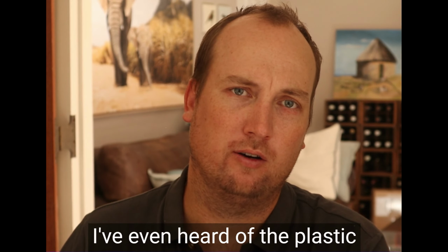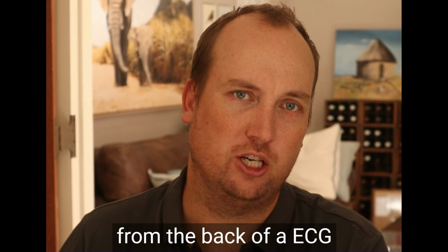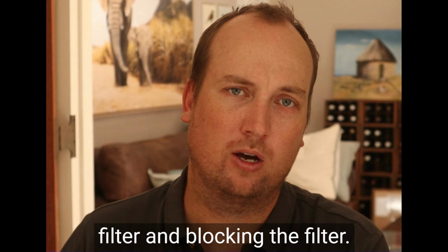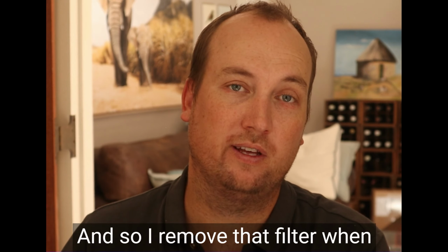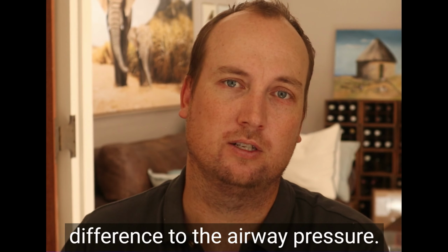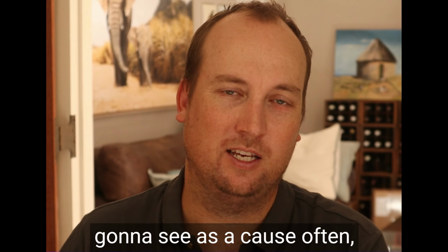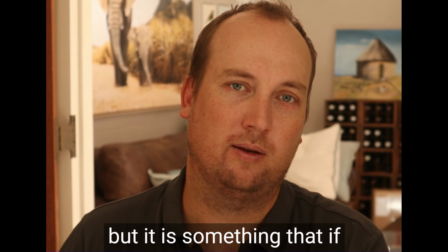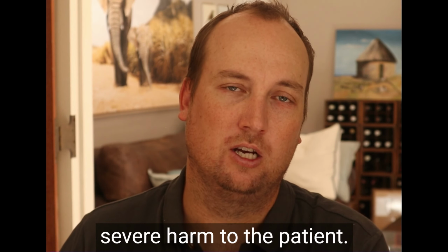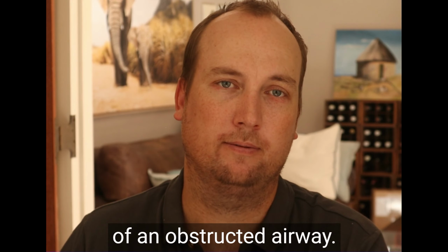I've even heard of the plastic from the back of an ECG sticker being stuck in the filter and blocking the filter. And so I remove that filter when I'm faced with high airway pressures, and I see if it makes a difference to the airway pressure. It's not something that one's going to see as a cause often, but it is something that, if you miss it, can result in severe harm to the patient. So don't forget that that filter can also be a cause of an obstructed airway.